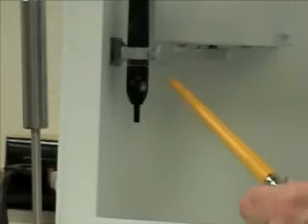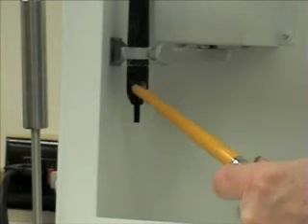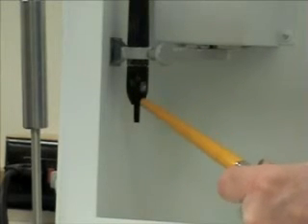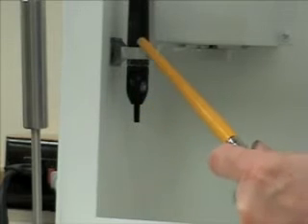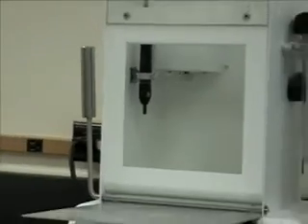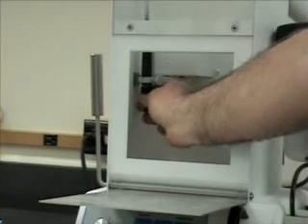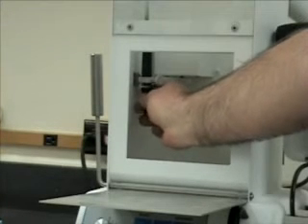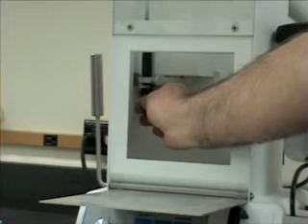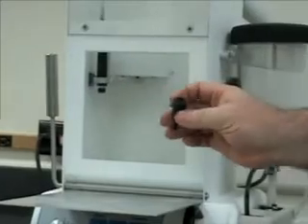Okay, the next thing we're going to do is inspect the O-ring seal in the tip of the unit. This is a plastic housing that unscrews the tip assembly from the wand up above here, and we'll disassemble that and inspect it. Okay, I'm going to reach inside the unit and unscrew the housing from the wand. I'm going to keep it upright at all times because I don't want to lose the O-ring inside.